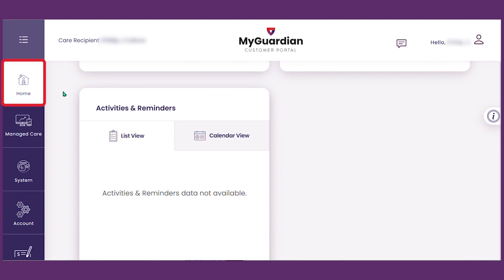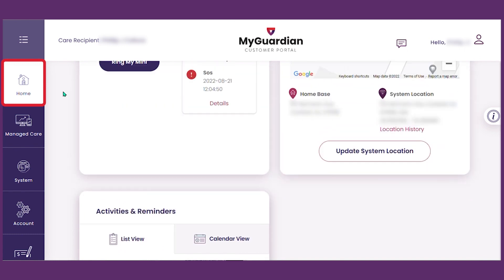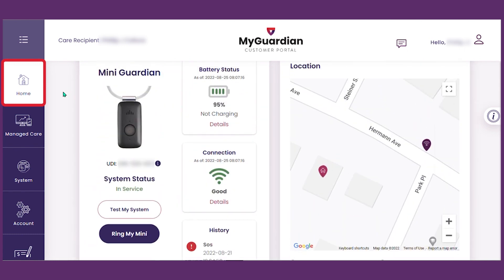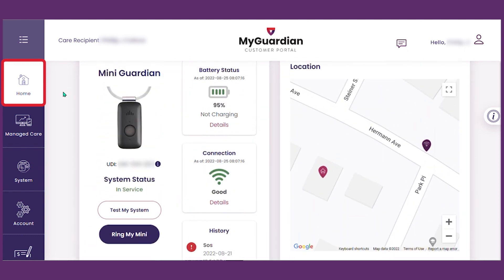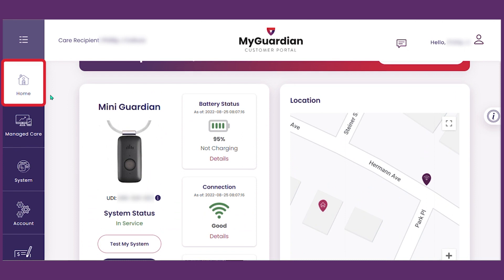Medical Guardian offers a variety of devices to meet your needs. In this video, you are seeing information and features for the Mini Guardian device. If you have a different device, your account could display additional or fewer features.